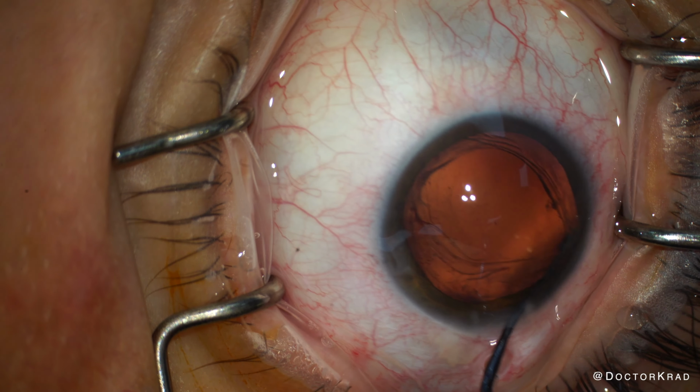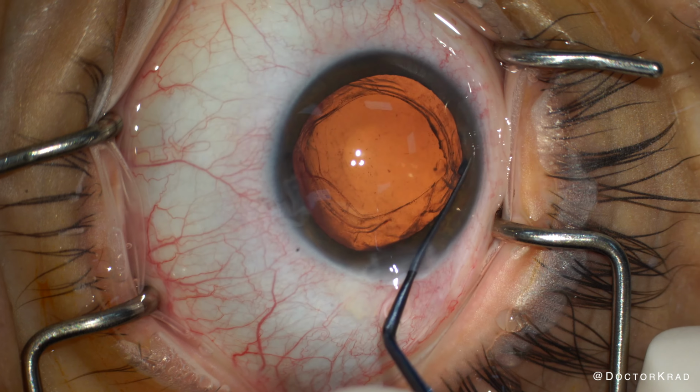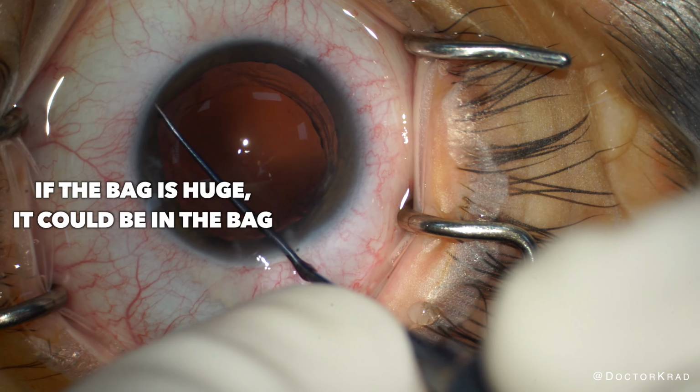Is the CTR in the bag? I don't see the eyelets anywhere. Is it in the sulcus, possibly? The patient does have a very big eye and perhaps a very large capsular bag.